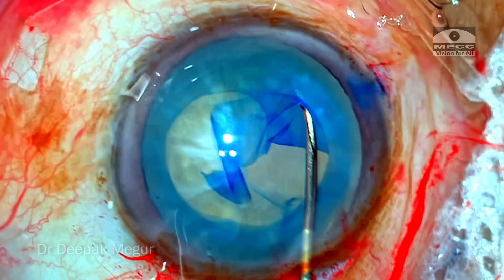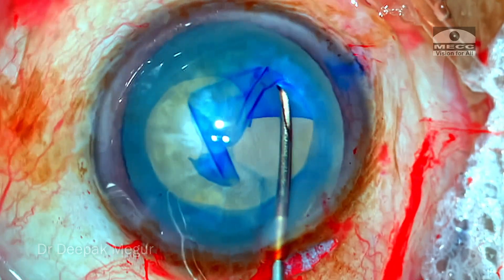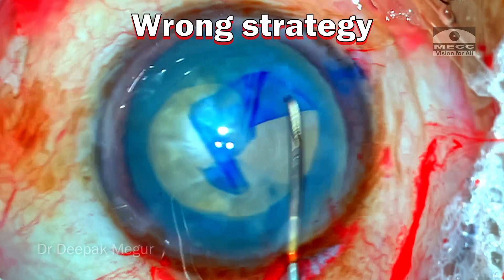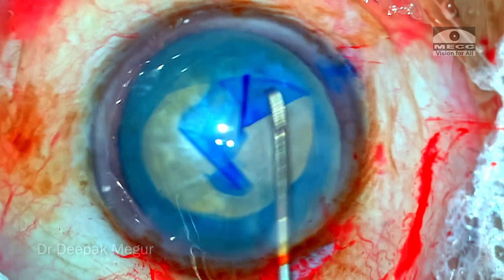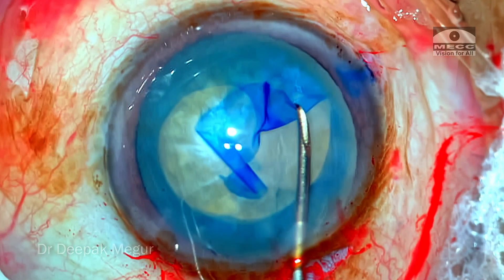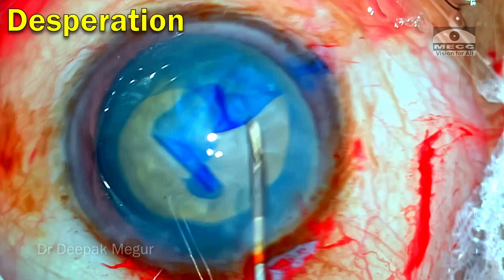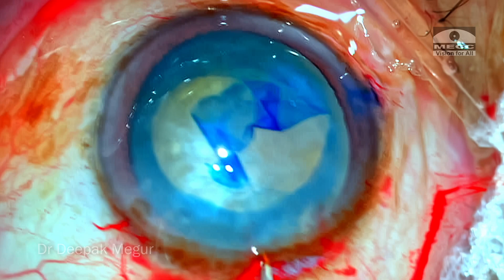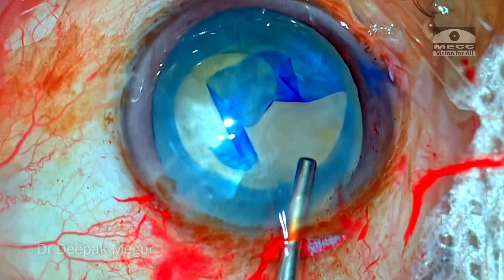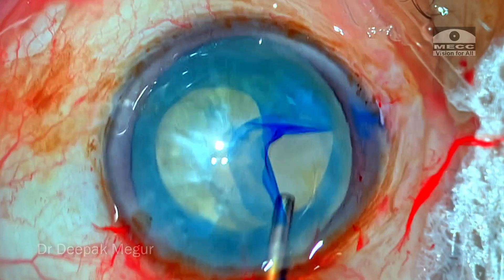This is the right time to change the course of the rhexis. The surgeon is aware and trying to curb the course, pulling it slightly inside. But the strategy is wrong — although his intention is to pull, the direction of the tear is still taking it away towards the equator. The surgeon is finding himself a little helpless, with a couple of desperate strokes trying to pull it towards center, but they're not brave enough. Nevertheless, the surgeon goes back and refills the OVD, which is the right thing to do.